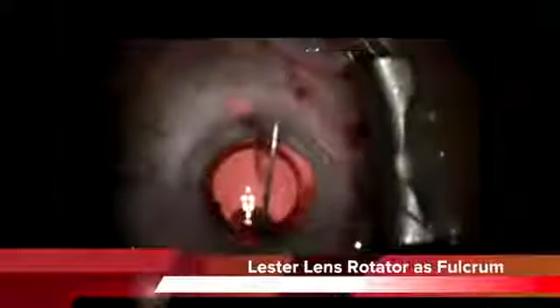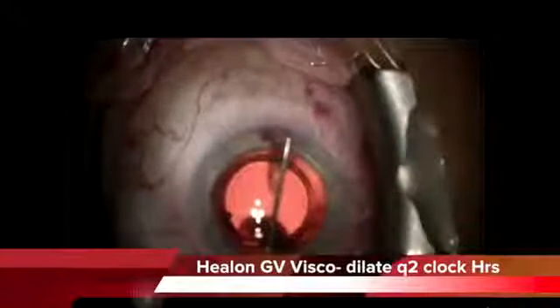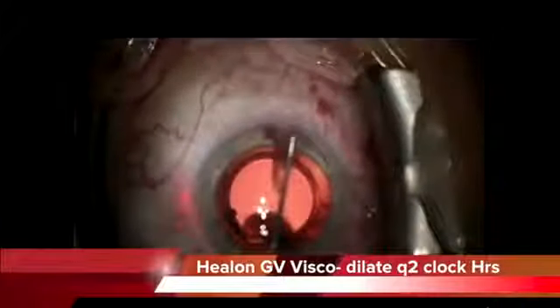Now it's important that the catheter have been primed before we entered the eye, and also very importantly at this point we want to reprime the catheter with several clicks until we see some Healon oozing from the tip before we begin to pull it back. Here I have inserted a Lester lens rotator and am holding it up against the catheter so as to help act as a fulcrum to avoid traumatizing the canal. Every 2 clock hours, my nurse turns the dial on the Healon, so we introduce Healon every 2 clock hours as we are smoothly withdrawing the microcatheter.